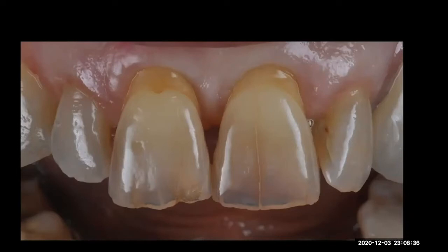That's why we can see all the translucency through the buccal. What happened? The oral concavity is dark, so translucency plus dark, you can create some kind of translucency.